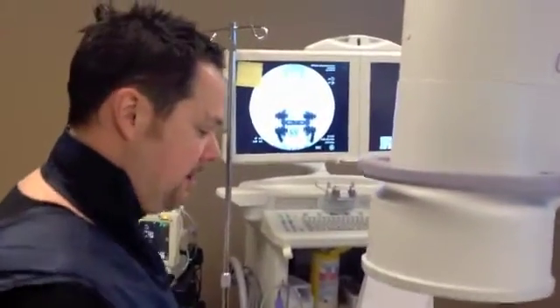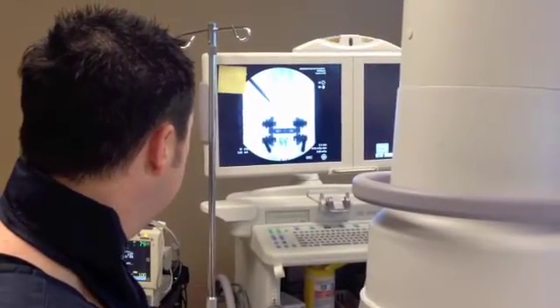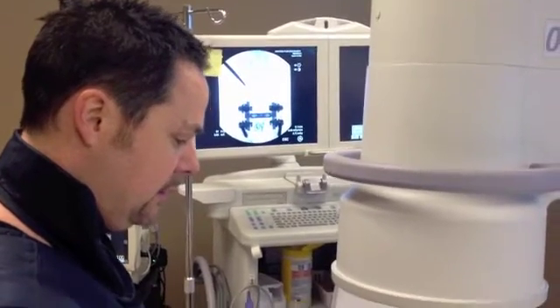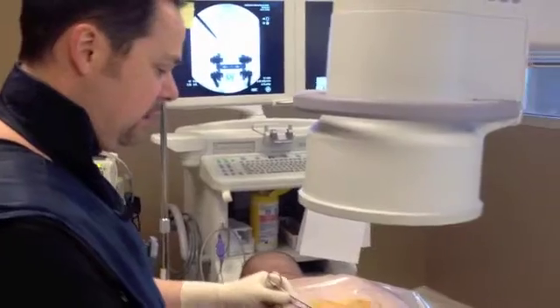You're watching on x-ray screen. I'm going to numb the skin first. And that's the junction of the superarticular process and transverse process, right to the superior and lateral aspect of the pedicle.